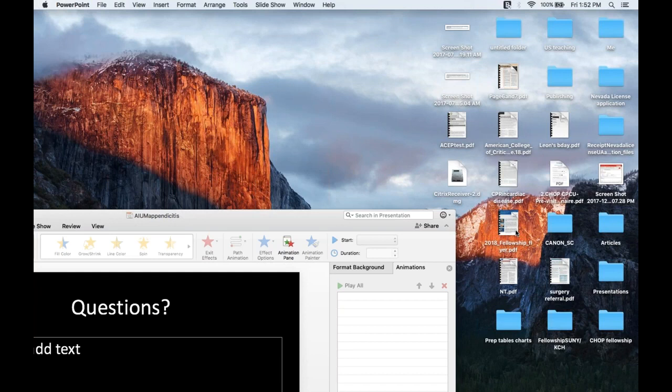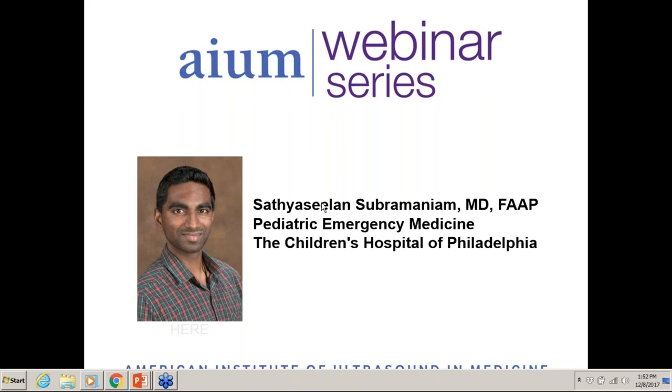Is a retrocecal appendicitis diagnosable with the ultrasound? I think in very experienced hands, this is definitely possible. There are methods where, just like you are palpating, for example, in flank pain, you slide your hand posteriorly. You can do that closer down in the right posterior part of the abdomen, and then push upwards to try to bring that retrocecal appendix out behind the cecum. So it is possible. Now that's one way of doing it.